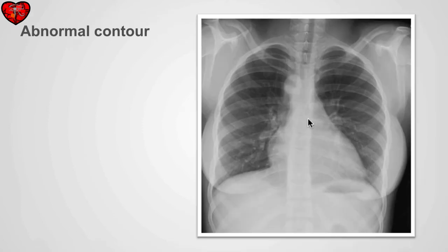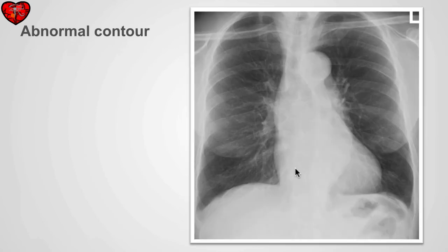In this case, we see an abnormal contour on the right. Instead of only having the superior vena cava superiorly, we see an additional contour caused by a right-sided aortic arch, which represents a normal variant in this patient. In another case, the right heart border is abnormal because of a dilated ascending aorta, giving a contour on the right that is normally not identified.